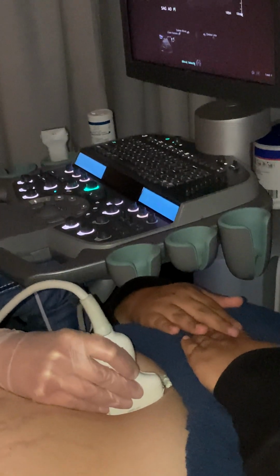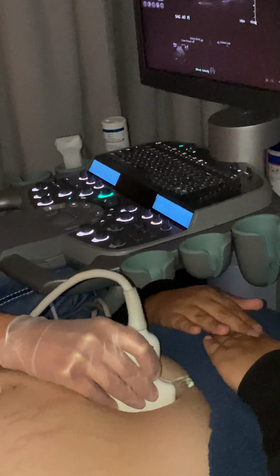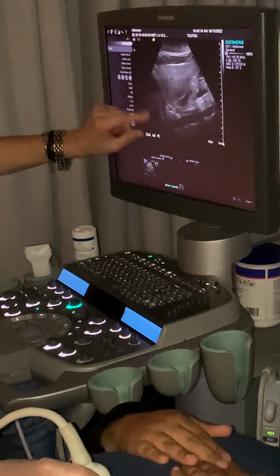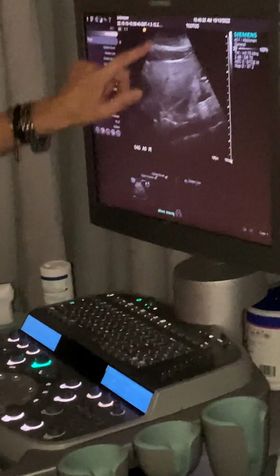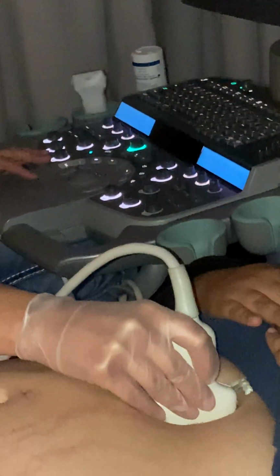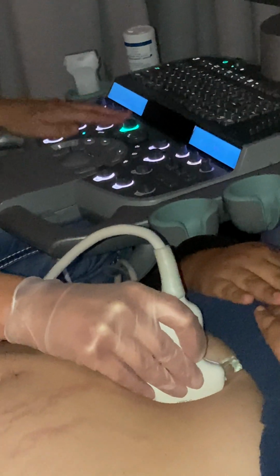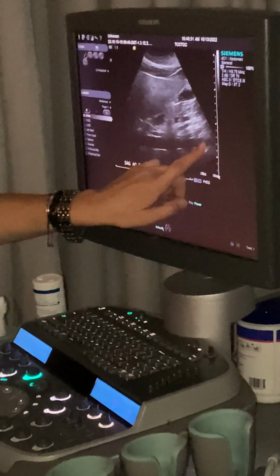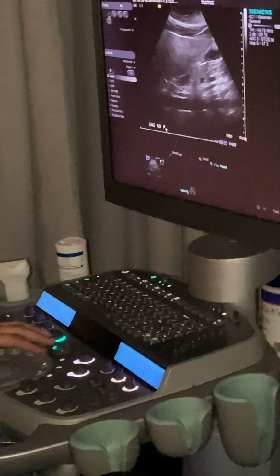But okay, so then we're going to move over to that aorta. He's going to be a little bit deeper, more retroperitoneal, and he doesn't touch the liver. So go ahead and take a big breath in. So we've got our proximal aorta. Now you'll notice that it has an angle to it. So I want to make less distance between the front of my transducer and the aorta. So I'm going to rock that transducer forward. You can see that then it makes everything horizontal. I've elongated out as much as I can across the screen. So we're going to take this as an image.